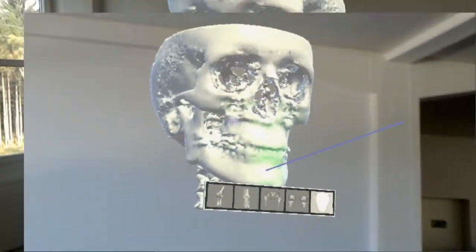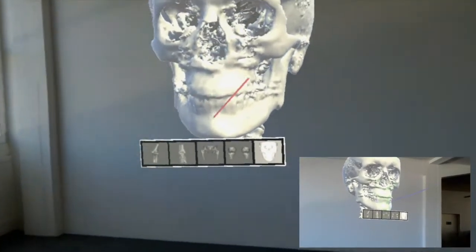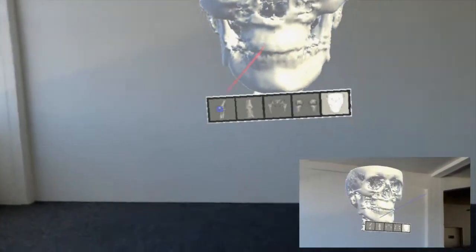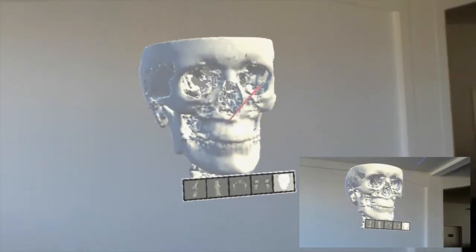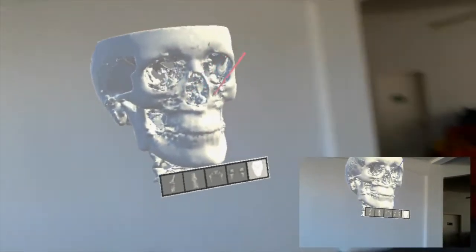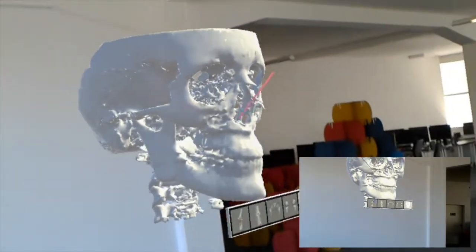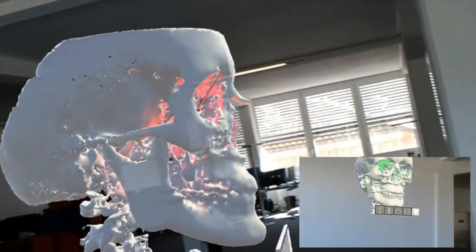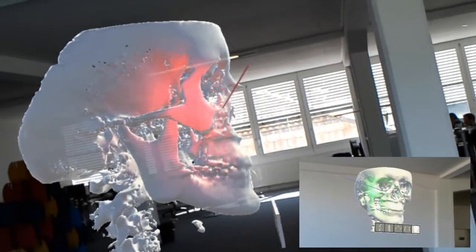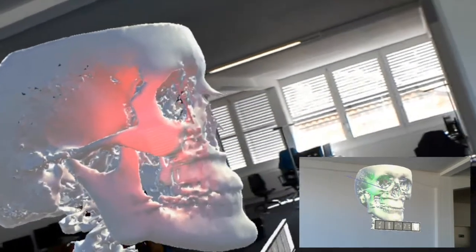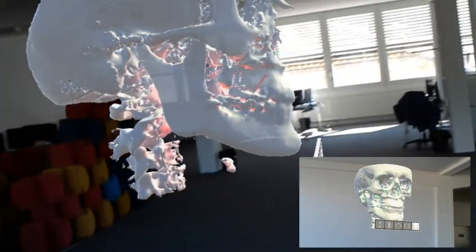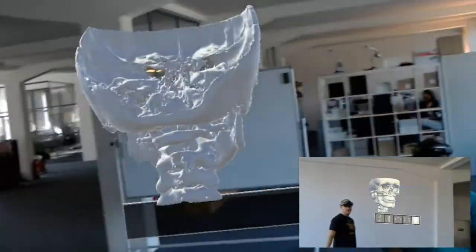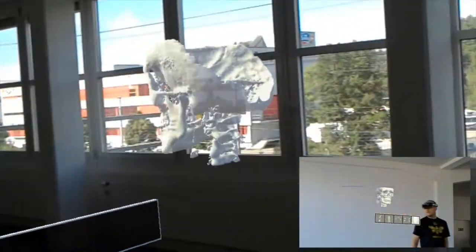The displayed hologram is synced across several devices, so two or more users can interact with the same model at the same time. We think that this experience is useful in several settings, for example an educational environment or a doctor-patient interaction.